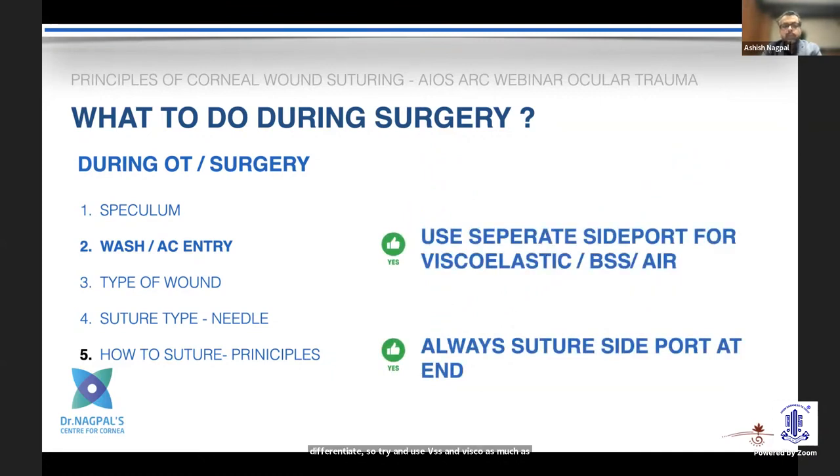Once you have established how large the corneal tear and wound is, you can introduce a side port — that is the best way. Do not try to introduce viscoelastic, BSS, or air from the main wound itself, although there may be times when there is no other option because the eye is very soft. You have to try and balance these situations. And whenever you finish the surgery, always suture up the side port as well.